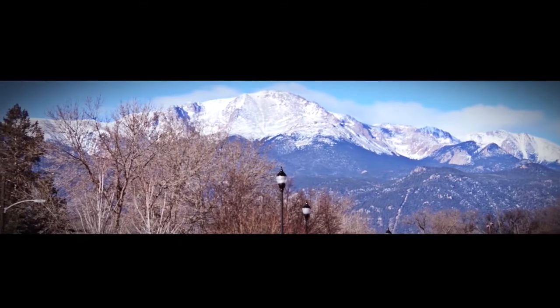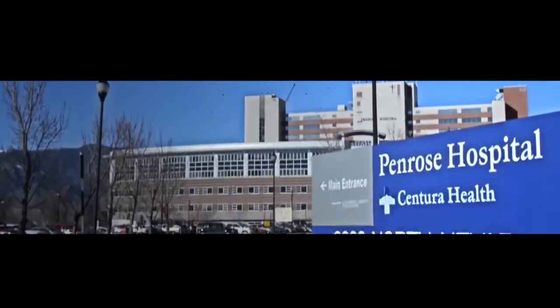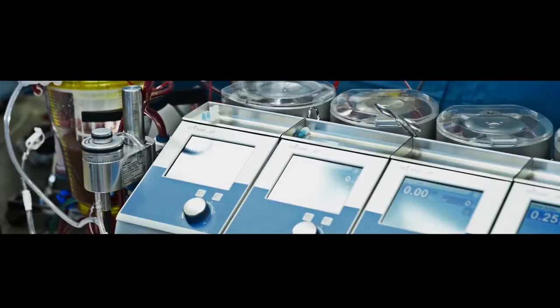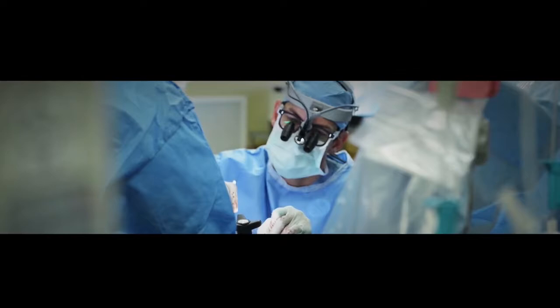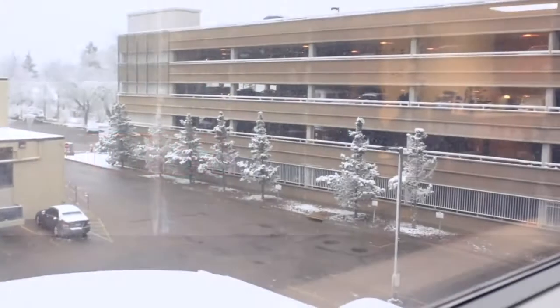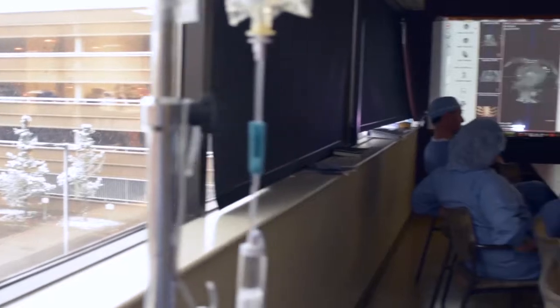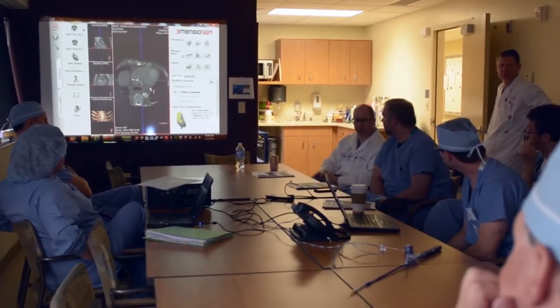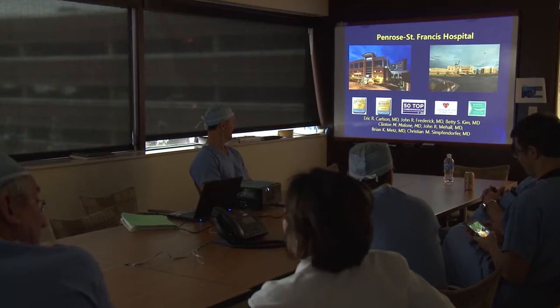The transcatheter aortic valve replacement process involves a multidisciplinary heart team evaluation consisting of 2 cardiac surgeons and an interventional cardiologist, along with extensive diagnostic testing and preoperative evaluation. The preoperative testing and evaluation is extremely important in selecting the correct approach and procedure for each patient.